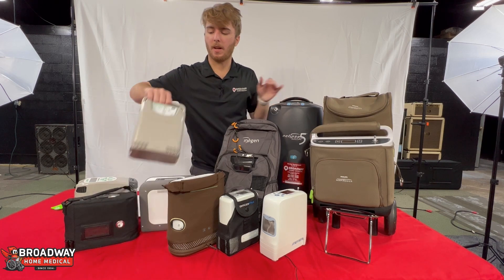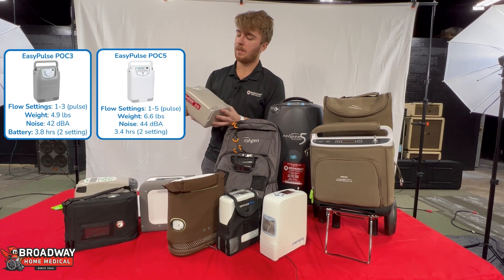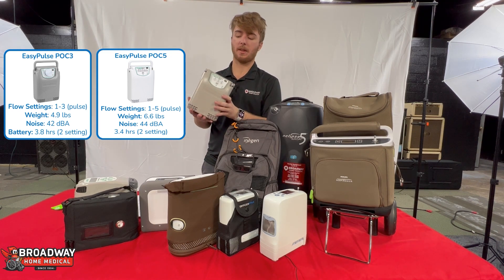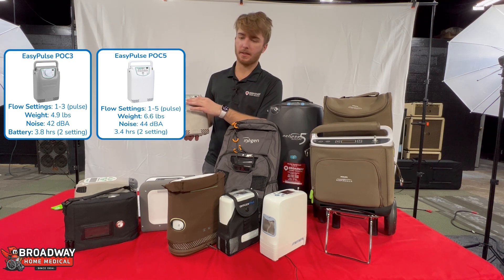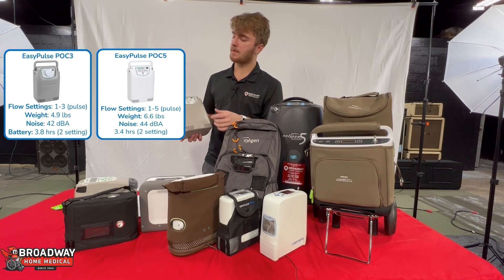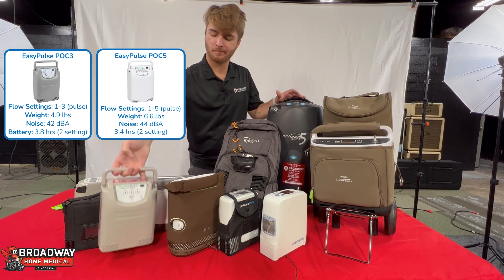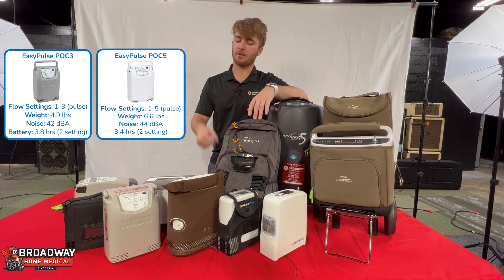The same is going to apply to the EasyPulse POC3. This is kind of the competitor to the G4 — it's really small and lightweight. Same thing with the screen: it's just one, two, three buttons and your off button. If you're looking for a more affordable small machine, that's the one to go with.